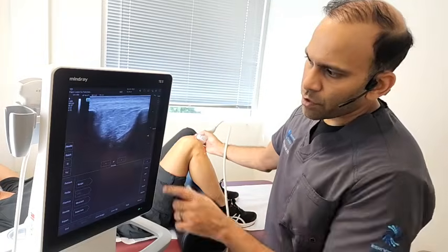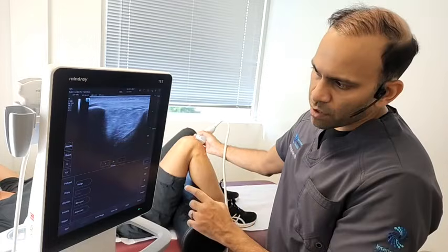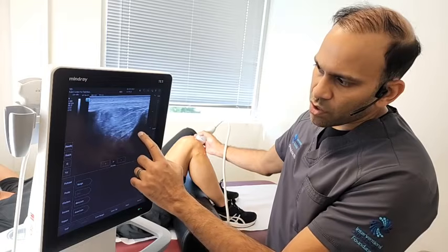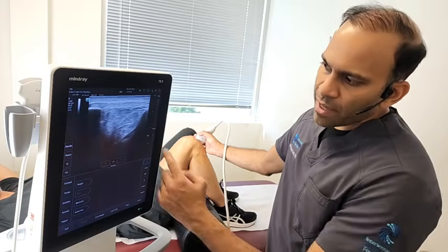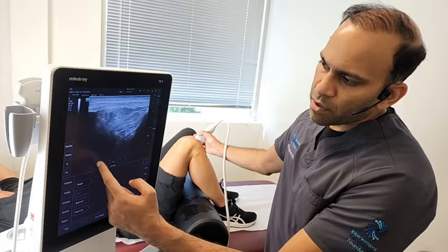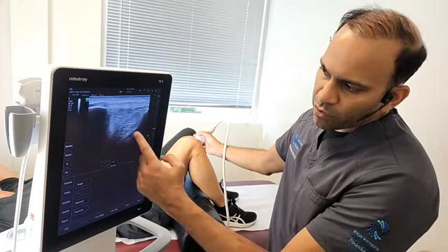So when we look over here, looking at the front of the knee, this is the kneecap here, this is the lower leg bone. And when we're looking really deep inside the knee, this structure that you see going in this direction right here is actually part of her ACL. And this ACL connects the lower leg bone all the way to the femur, which is deeper than this. But this line is a piece of the ACL that we see here. And we see that it's going in the right direction.